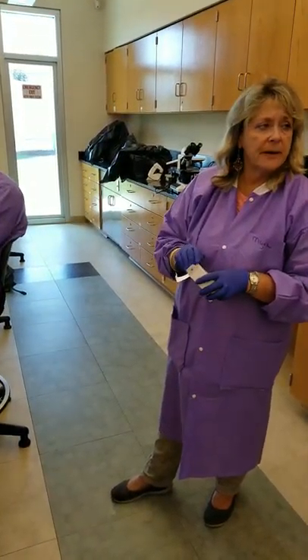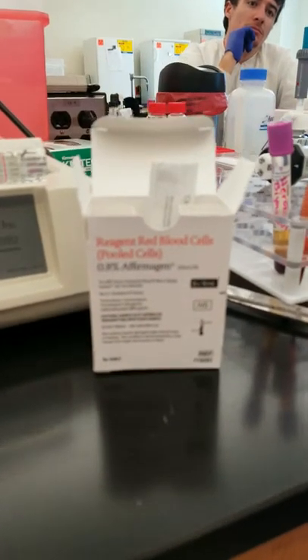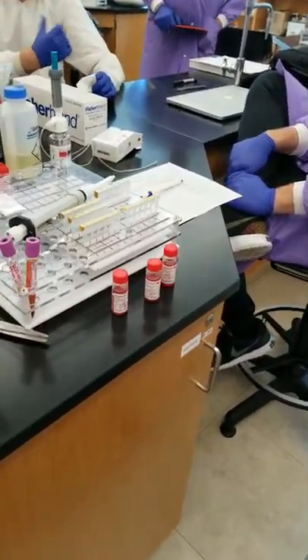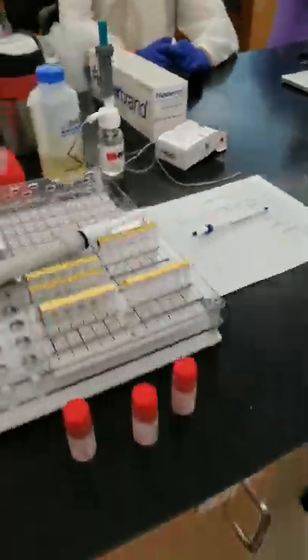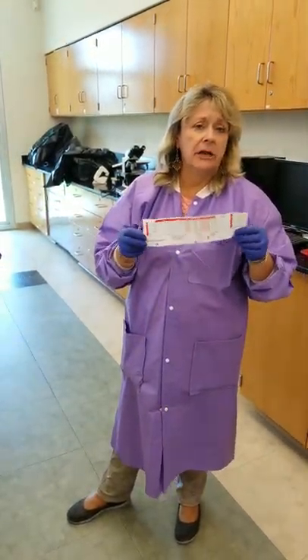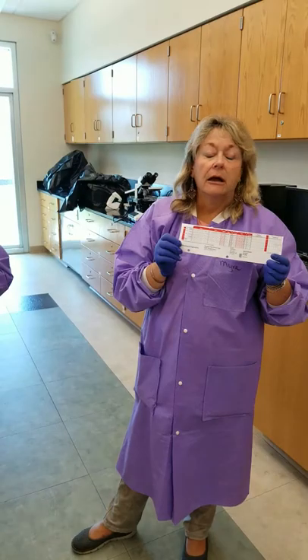These are the screen cells that we talked about this morning to do the antibody screen. A particular set of 1, 2, and 3. Okay. They too are 0.8%. This is the antigram that comes with each individual lot number, and it will tell you which of the cells are positive for which of the antigens. So this is a very important piece of paper to have when you're doing an antibody screen, because if it's negative, you really don't care much, but if it's positive, this is going to be a big clue as to what the identity of your antibody could possibly be, and that's the name of the game. That's what we're basically doing.